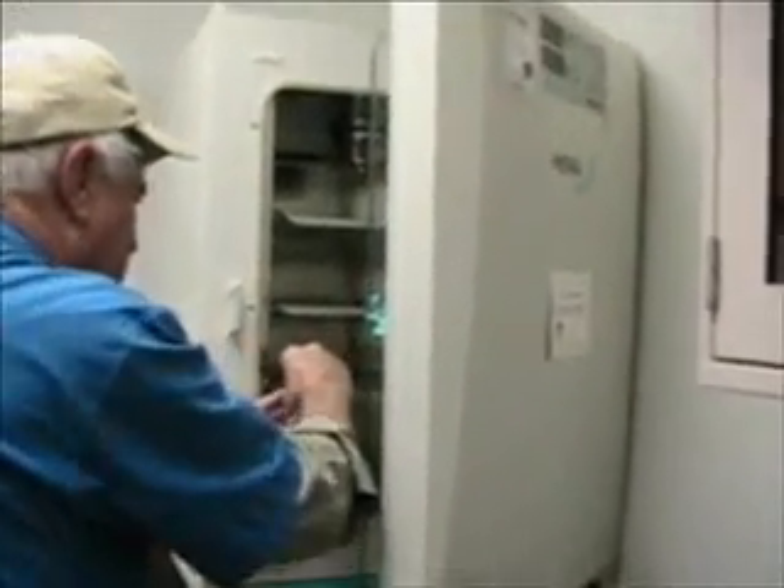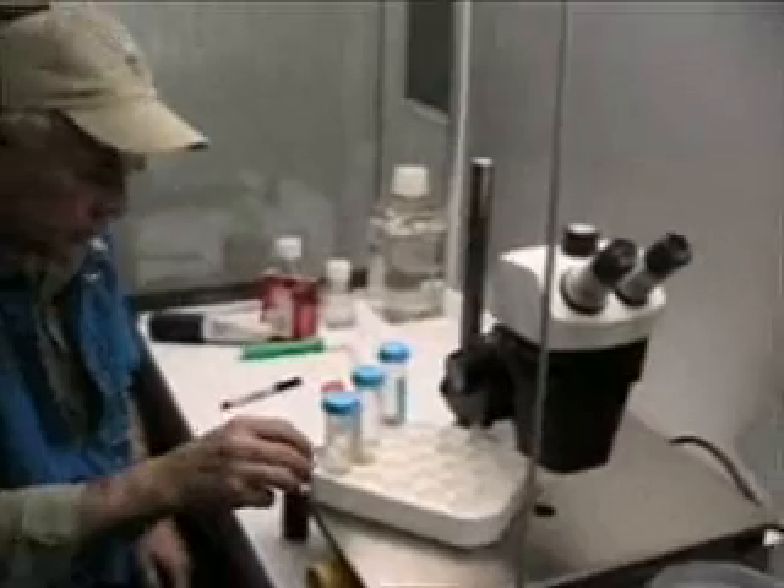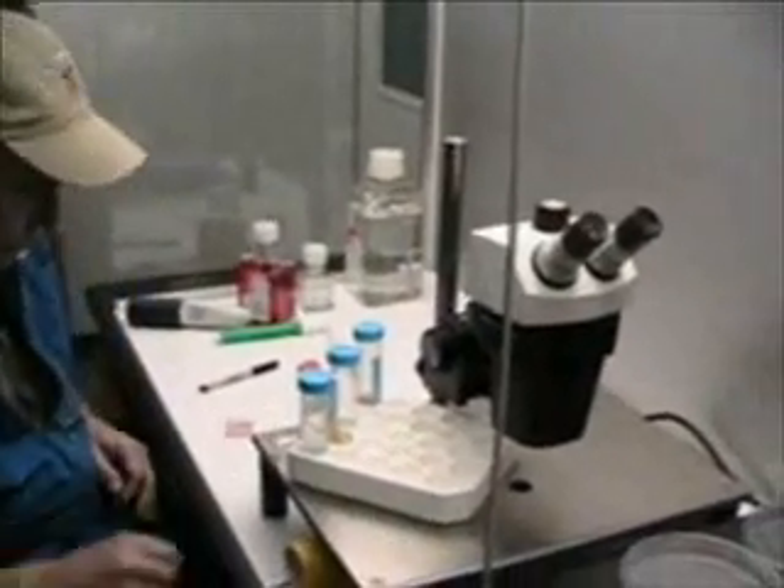Once the oocyte is found, we have to wash it in rinse media, place it in a culture dish, and put it in the incubator to mature. This process, of course, requires extreme cleanliness.